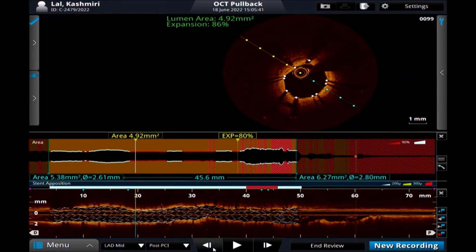No, I don't expect any perforation, but my first comment is I still feel the stent is very much under expanded in the proximal part. The proximal part has to be bigger. The left main is 5. The distal vessel is almost 4, 3.84. And the proximal vessel is still smaller looking, at least on the angio and also on the OCT longitudinal view. So you need to expand the proximal part, that's one.